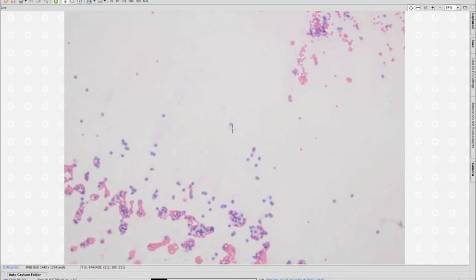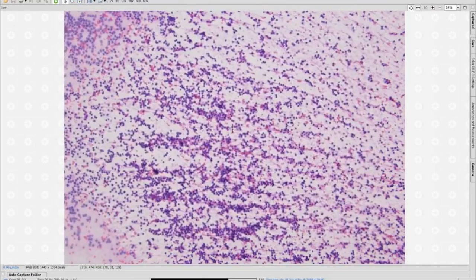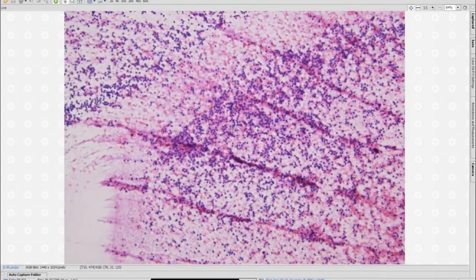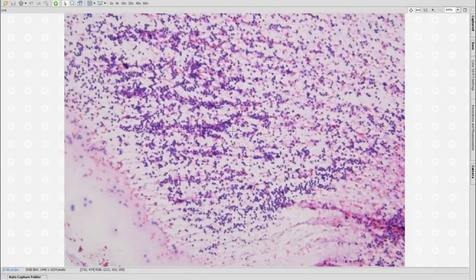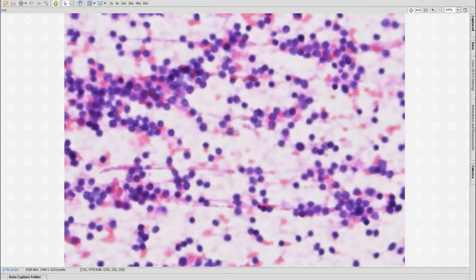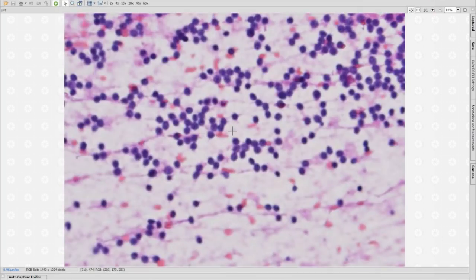And this was label 1A in your virtual slides. It's not the most attractive smear, but it's very illustrative, and there's a reason why I placed it. If you see the smear, it is cellular. It spreads well. It's not the best, so you are in doubt a little bit. Well, are you sure it's not just a normal pituitary? You go on higher power, and you can start seeing that probably the cells are not spreading very well, but they are still the same cell type, probably.